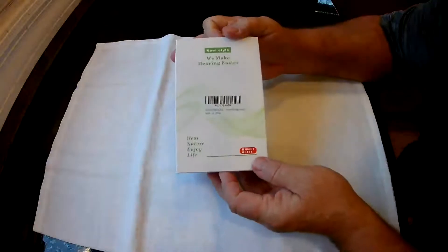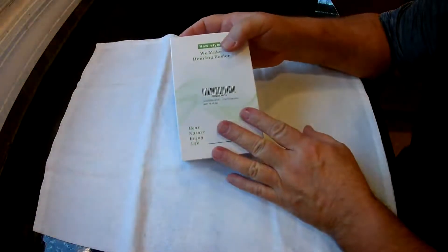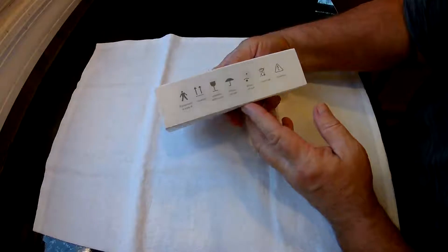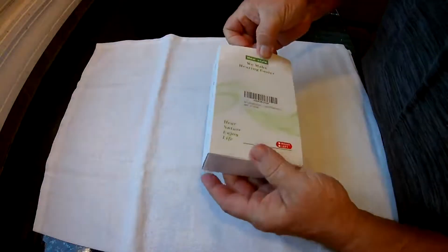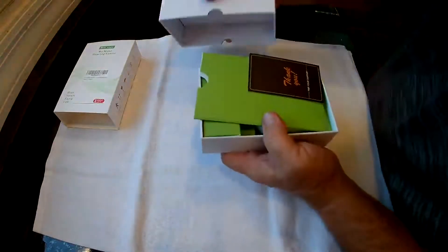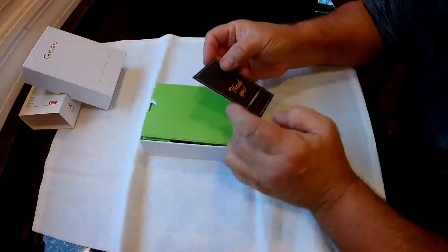This is the Good Me invisible hearing aids. There's a pair of them, two in the box. Each one has a 60 milliamp battery which takes about an hour to charge and is supposed to last a hundred hours.